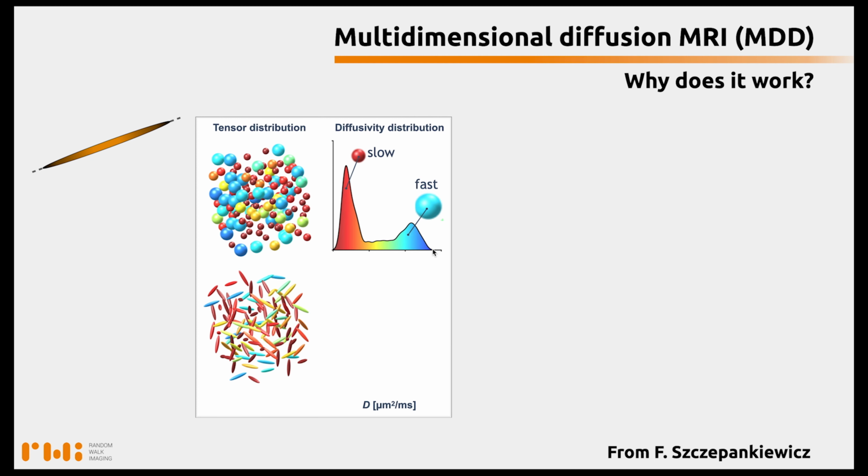one peak at fast diffusivities. If you use the same encoding to study this voxel content, and for this purpose I will copy and paste the axis of acquisition of this specific linear b-matrix or b-tensor, you will be sensitive to the high diffusivity along the acquisition axis for these blue tensors, but also to the small diffusivities acquired across the red tensors.